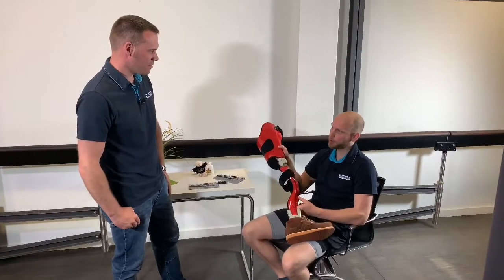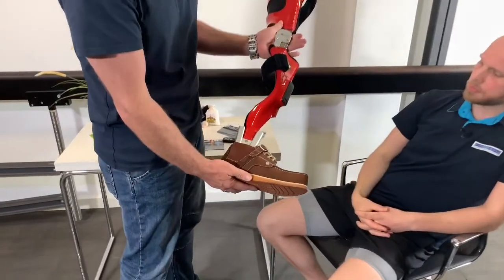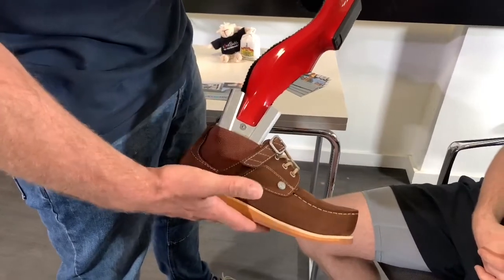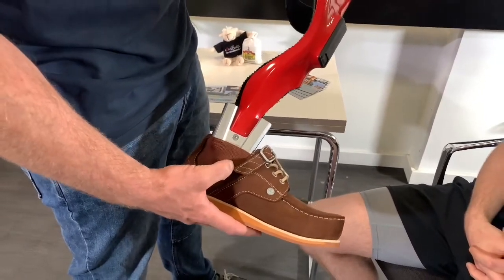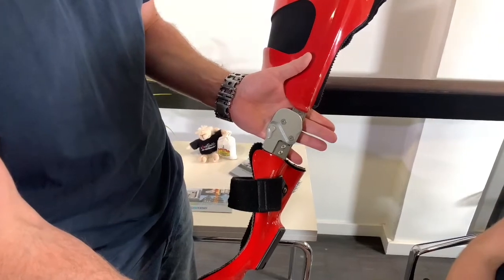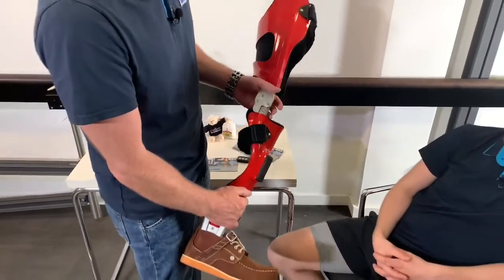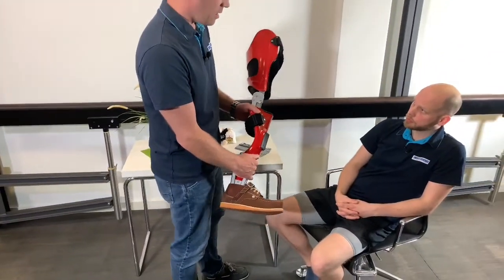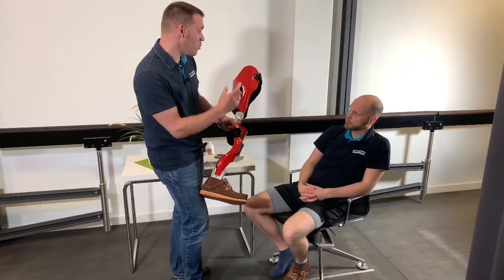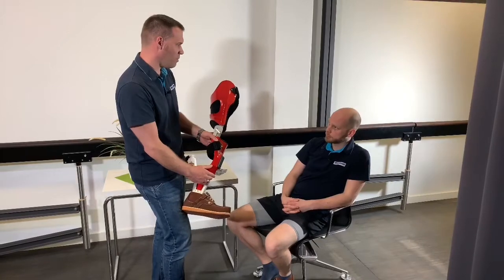Sebastian, can you explain the orthosis a little more? Of course. We have installed the Neuroswing joint at the ankle joint level. This joint has dynamic stops in the front and the back, and these can be adjusted to positively influence your gait pattern. On the knee level, we have installed the Neurotronic system knee joint. This is a stance phase control safety system, meaning the orthosis recognizes in the movement of the leg when the swing phase should take place, and unlocks at the moment of swing. This allows a very physiological gait with a very high level of safety.